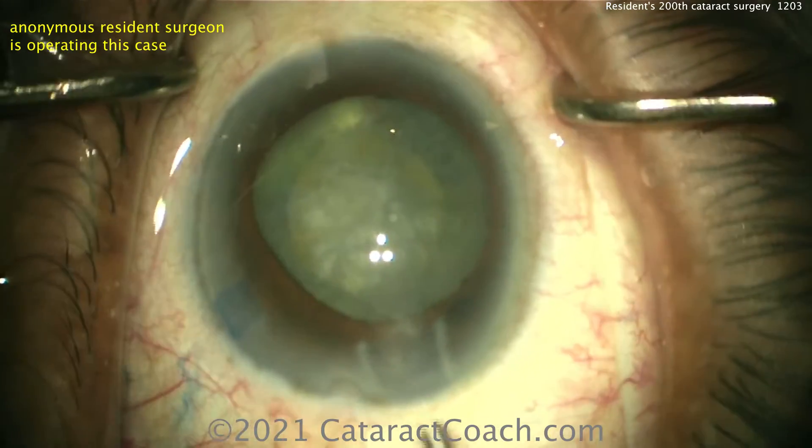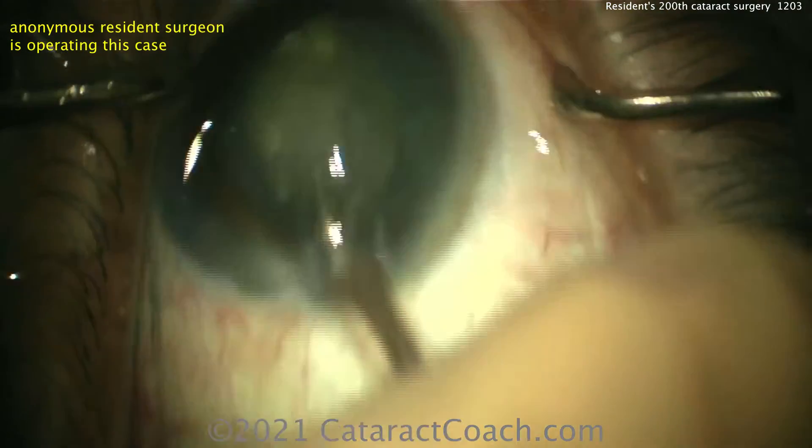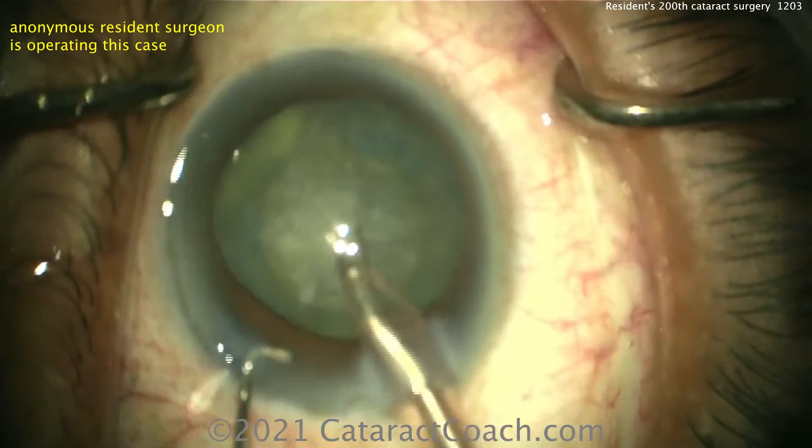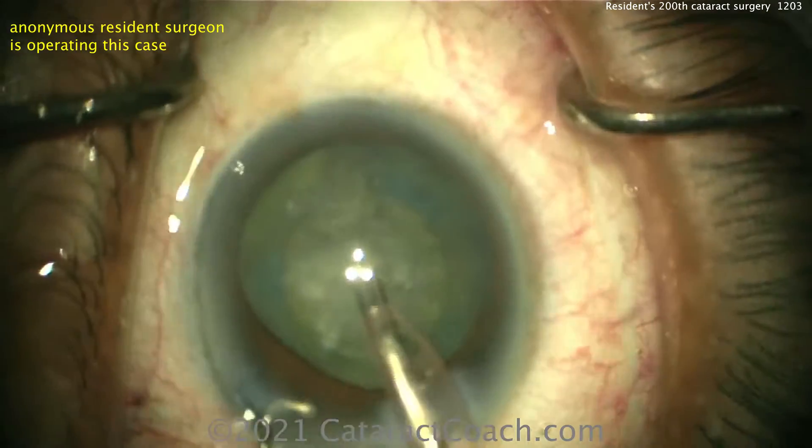Nice job using the trypan blue dye — we can still see that rhexis. Now given that it's a little bit smaller, you have to be very careful not to damage the rhexis edge with the phaco chopper or the phaco tip.